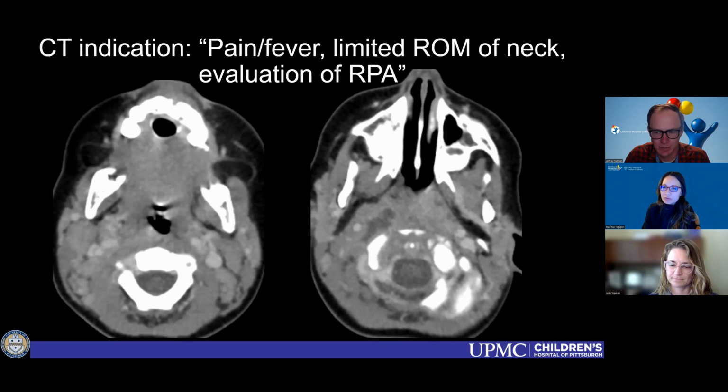Yeah, I agree. I mean, we don't do it enough, I feel, because maybe it's something that we're not used to and we don't know. Right, it's definitely an area where I think we can potentially add value, especially if there are chunky lymph nodes and you can go searching. It's part of our protocol already to look at the thyroid and just make sure it's there, especially in older kids where it might be PTC, metastatic lymph nodes from thyroid cancer. So maybe we'll just add a quick scan, level 1 with a nice deep depth.